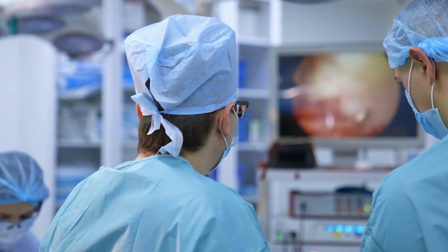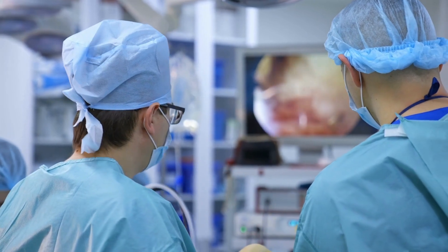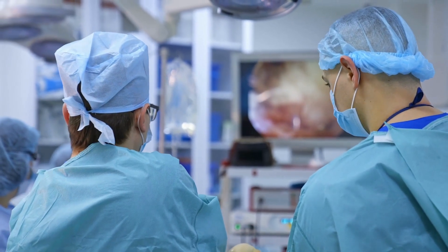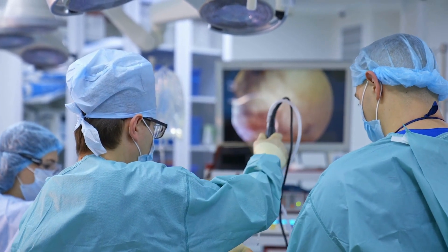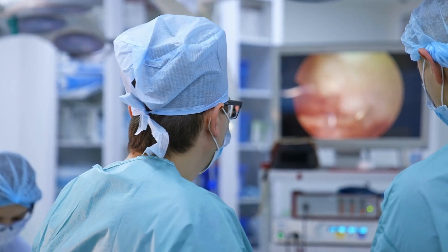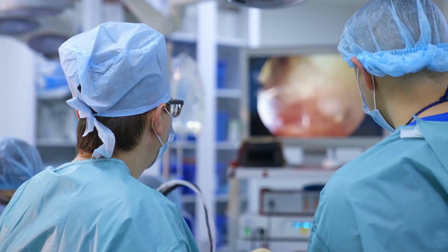Laparoscopic instruments are very difficult to clean and that is because of several reasons. The first and foremost is their complex design. Most of the laparoscopic instruments have multiple joints, crevices, and channels which make it very challenging to clean all the surfaces thoroughly.